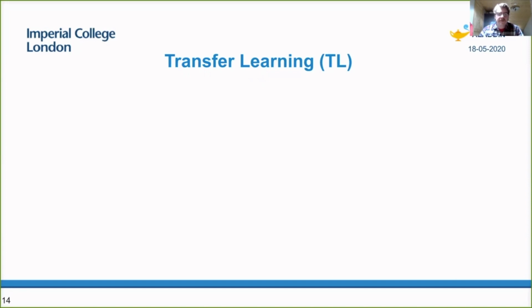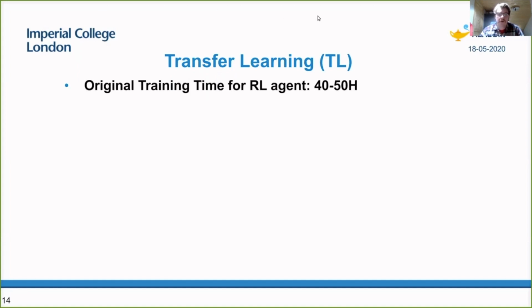Parallel to developments related to user interaction with the reinforcement learning framework, the project also explored the use of transfer learning in training an agent to detect landmarks. For an agent to detect a landmark, a deep Q network is trained to predict the optimal action for finding a target landmark given the agent's current location in an image. This training process requires 40 to 50 hours of training time, even on very powerful GPUs such as the Titan XP. Medical images usually contain several landmarks of interest, each normally requiring its own independent training process.